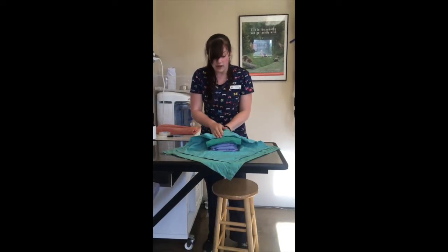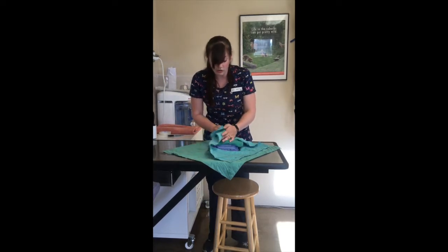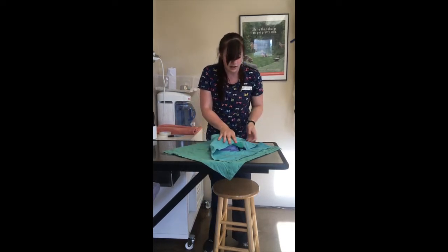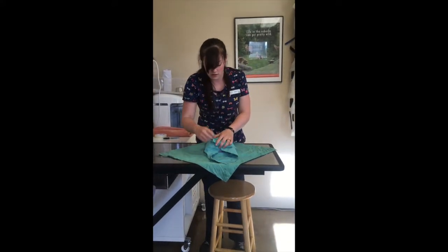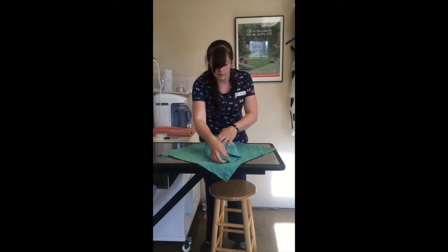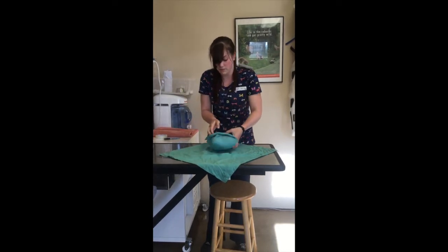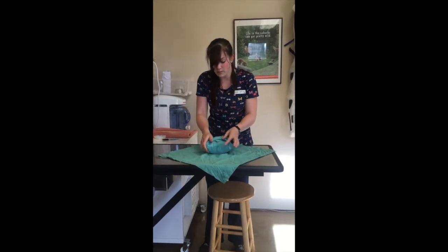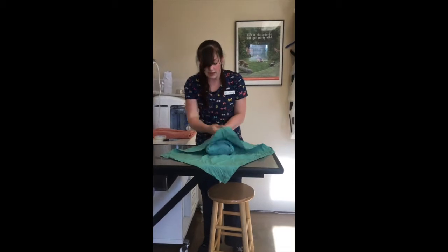I want to make sure that I wrap it snug but not too tight so that enough pressure can get through the pack to completely sterilize it. Making sure I leave a tab so it can be easily opened. And then I'm going to go ahead and wrap the outer portion.